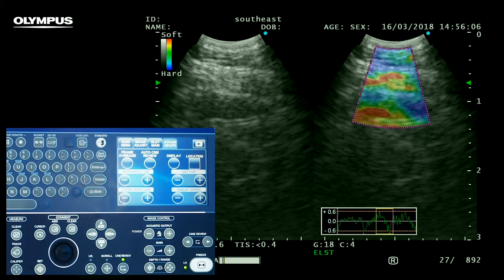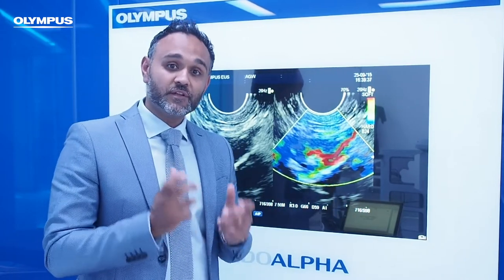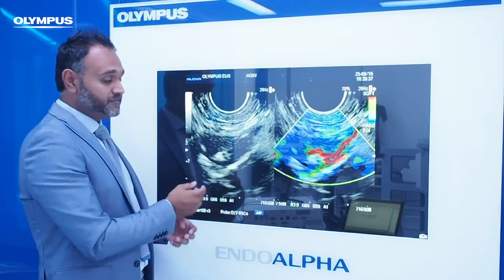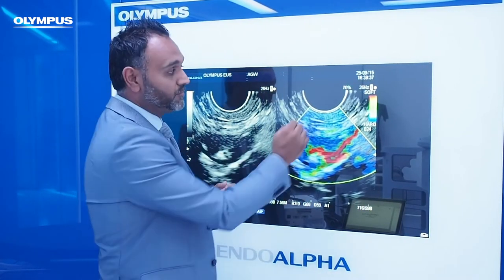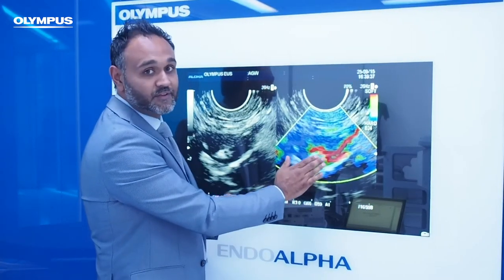We now have an excellent qualitative assessment of relative stiffness for our target lesion. You can stop your assessment here if your primary concern is to determine the relative stiffness of your target lesion. For example, we have a lymph node here — unreactive, hard cortex, soft hilum — which corresponds to our colour overlay map with blue being hard in the cortex and red being our soft hilum area.